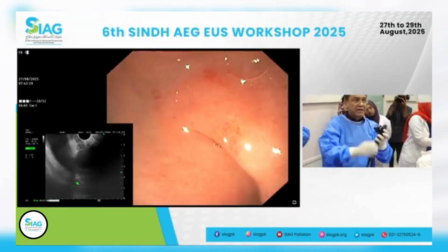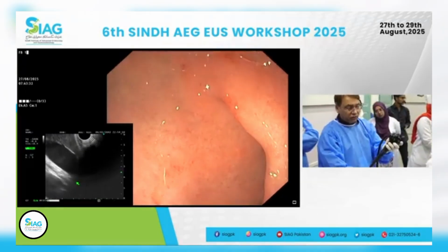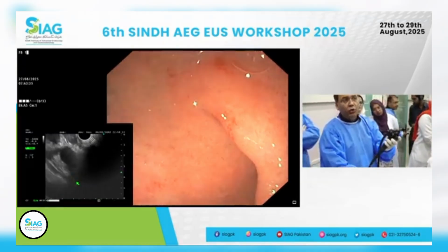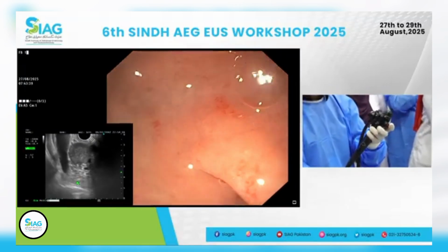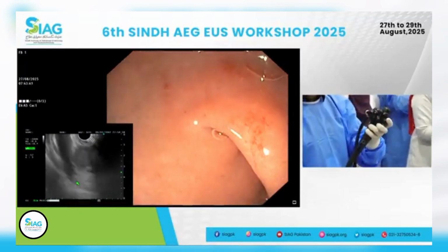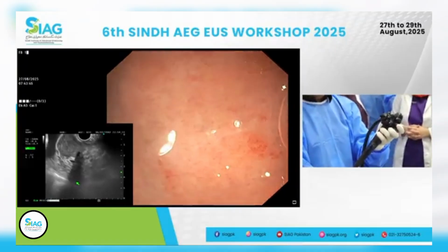So now I am into the duodenal bulb. I see the duodenal apex. My goal is to put the transducer, big wheel towards me a little bit, put the transducer right into the duodenal apex, right here in the left upper corner.